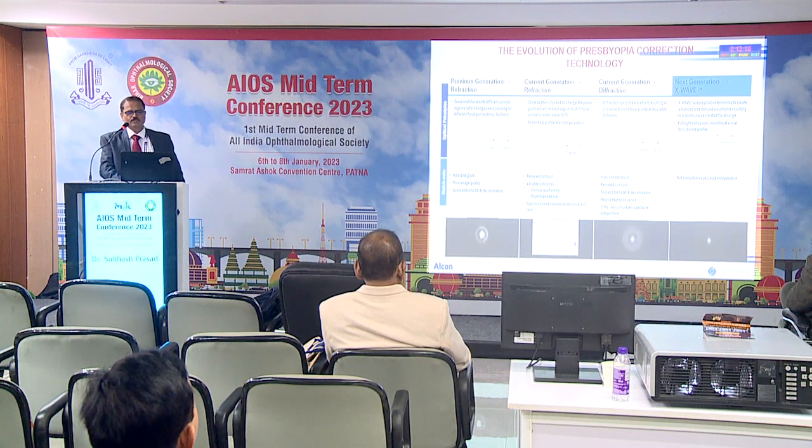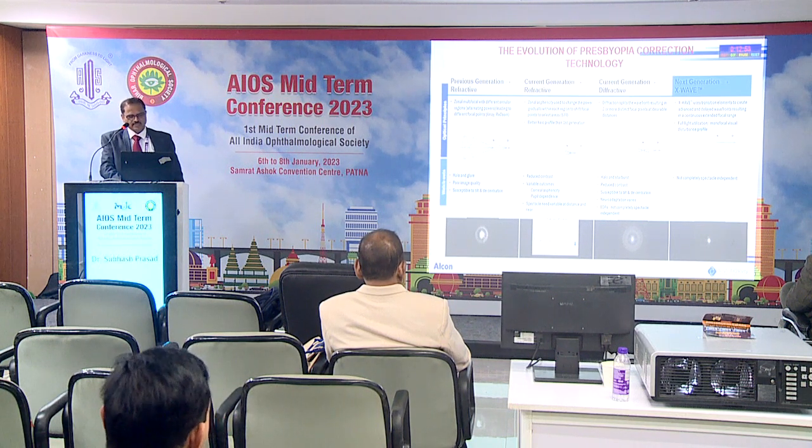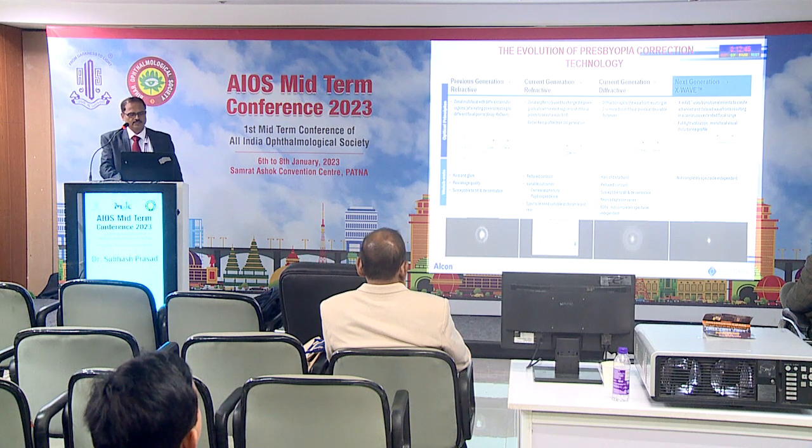Coming to the evolution of presbyopia-correcting lenses, the lens I was just describing was the refractive zonal type of multifocal lens that came by the name of Array, on a silicone platform. It had 5 zones of alternating refractive powers. The lens was giving relatively less dependency on glasses, but it was associated with a lot of halos, glare, and poor image quality, and it was susceptible to tilt and decentration, which could lead to other problems also. This was improved later on when zone asphericity was added to these refractive multifocal IOLs.